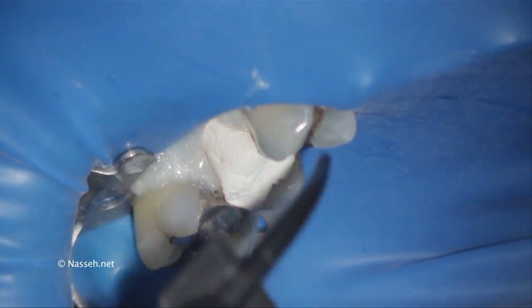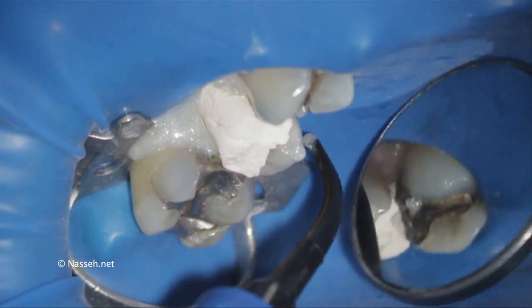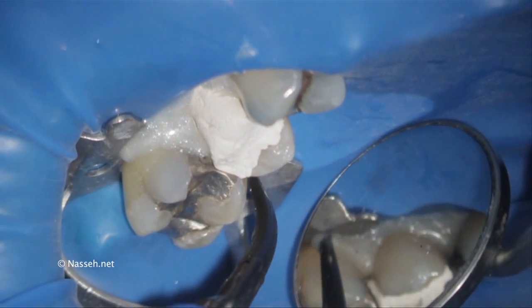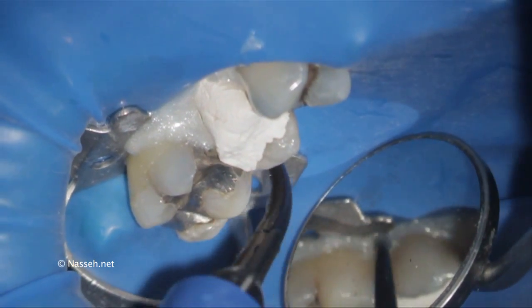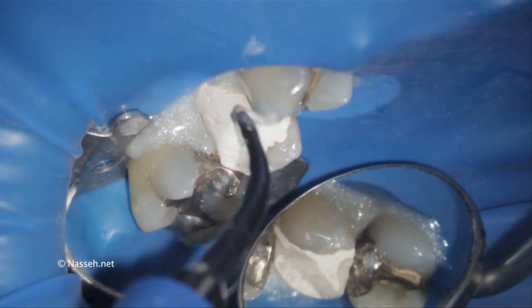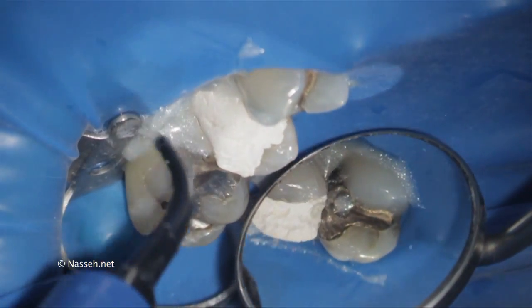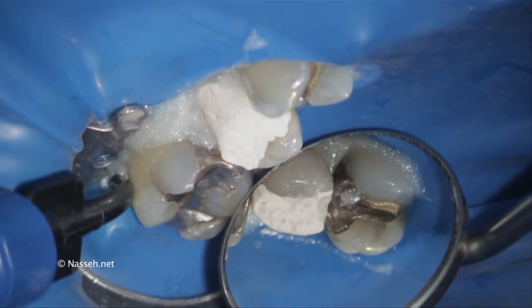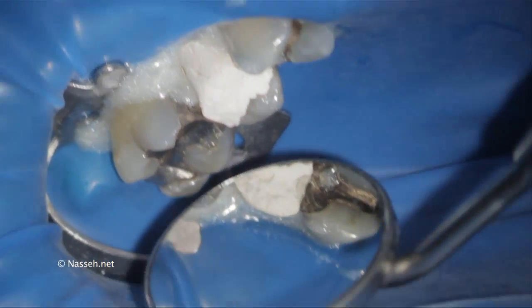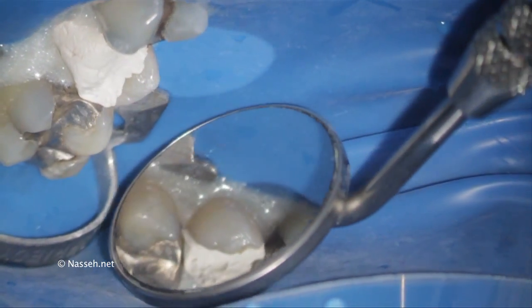This material is also used during bleaching in the anterior area to isolate the gums and keep them away from the hydrogen peroxide. Here, the application is to seal the areas of exposed gingiva and areas around the rubber dam where potential leakage of saliva and air from the patient's breath is possible.